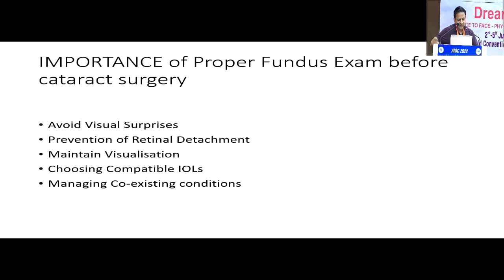So this is one patient. Preoperatively, we knew that there were breaks in the attached retina also. Although this was a small detachment, we were doing a vitrectomy here. There were two horseshoe tears, and we flattened the retina, and it flattened nicely, and we did cryo here. If I had not had that preoperative drawing in my mind, I may have missed the break that was in the attached retina. As you see, I had that preoperative drawing in my hand. I knew that there was a break in the attached retina, and so I was able to cover that also.